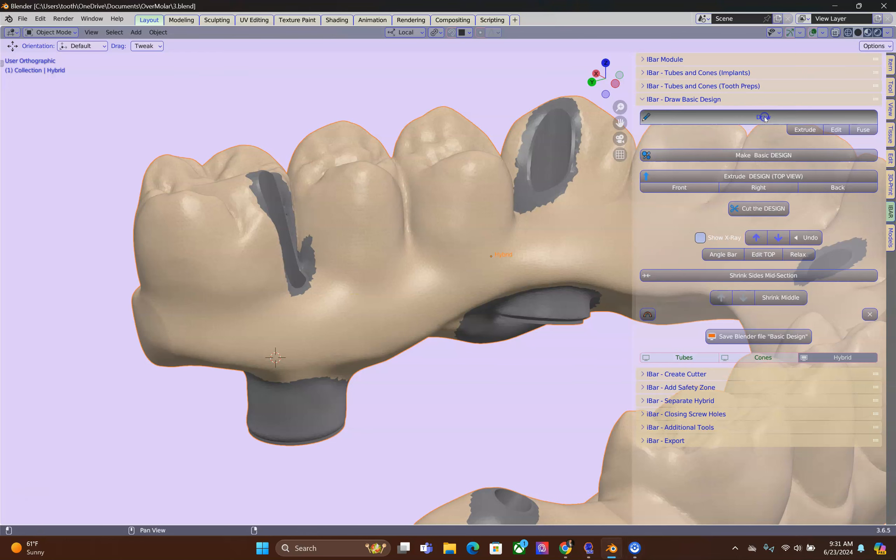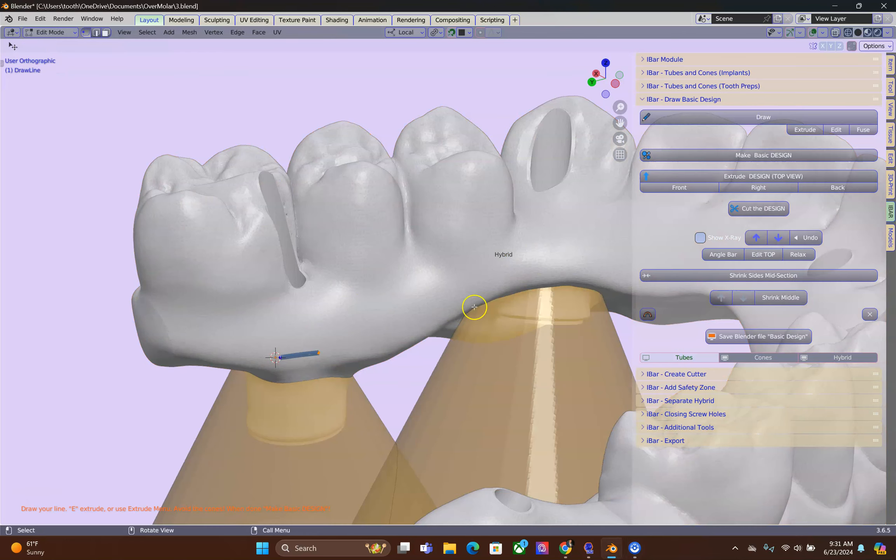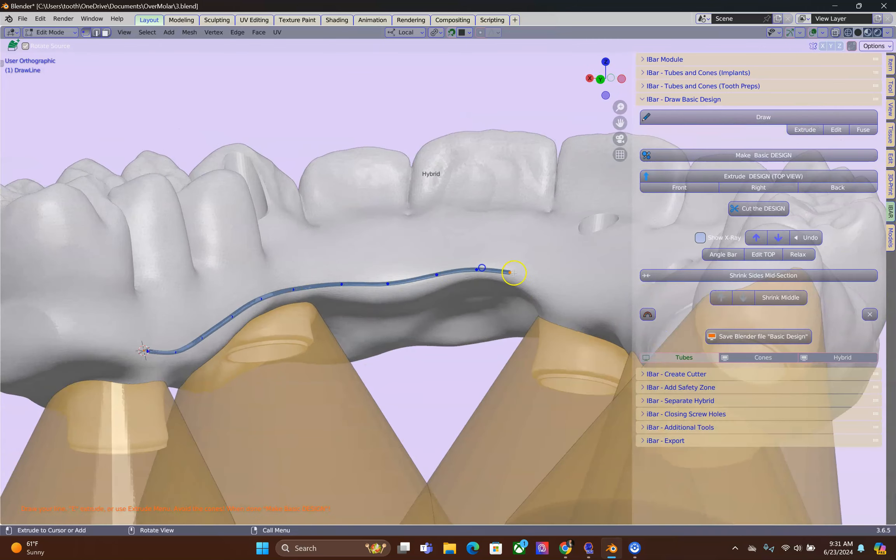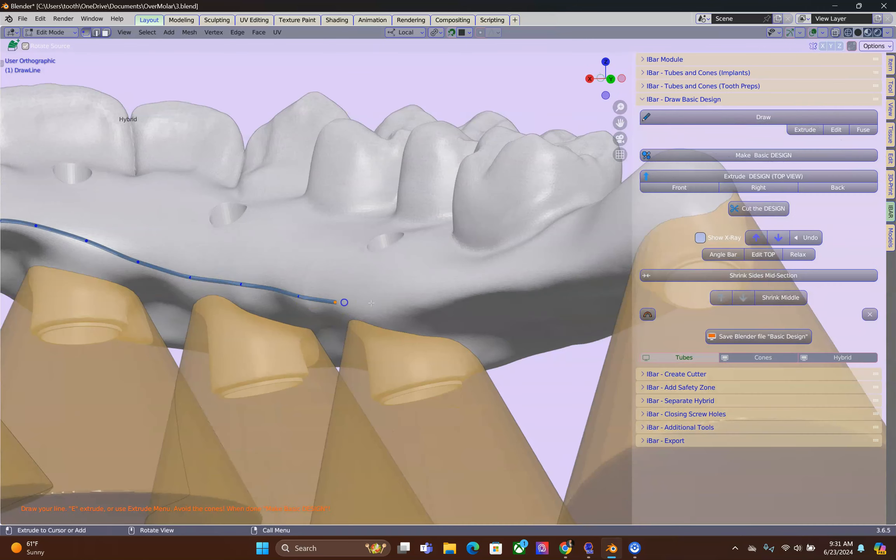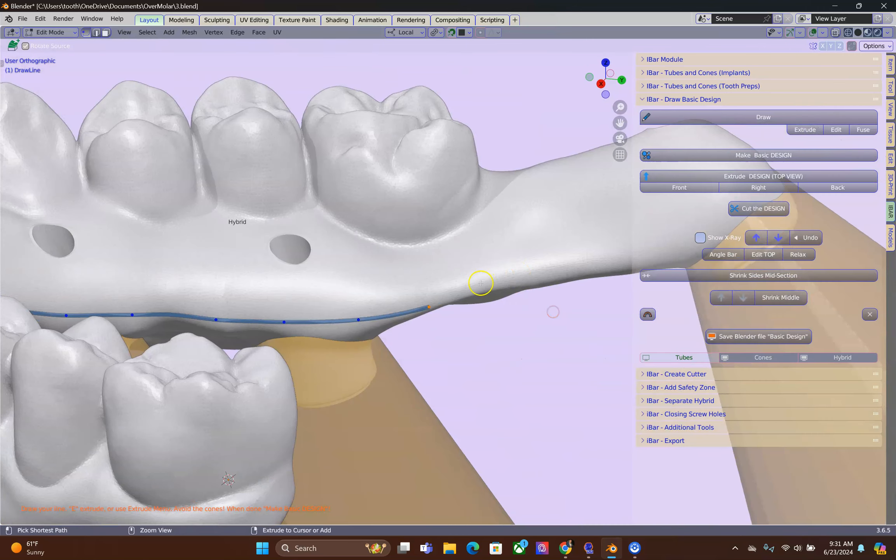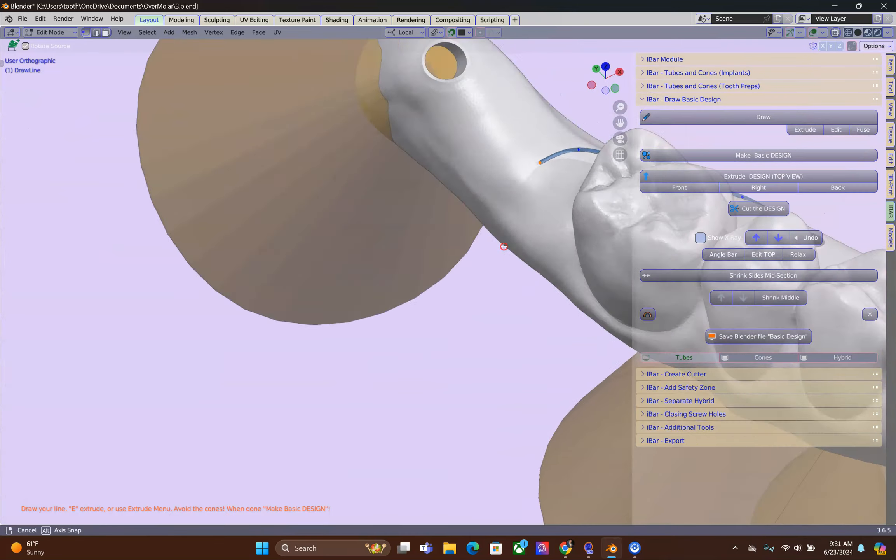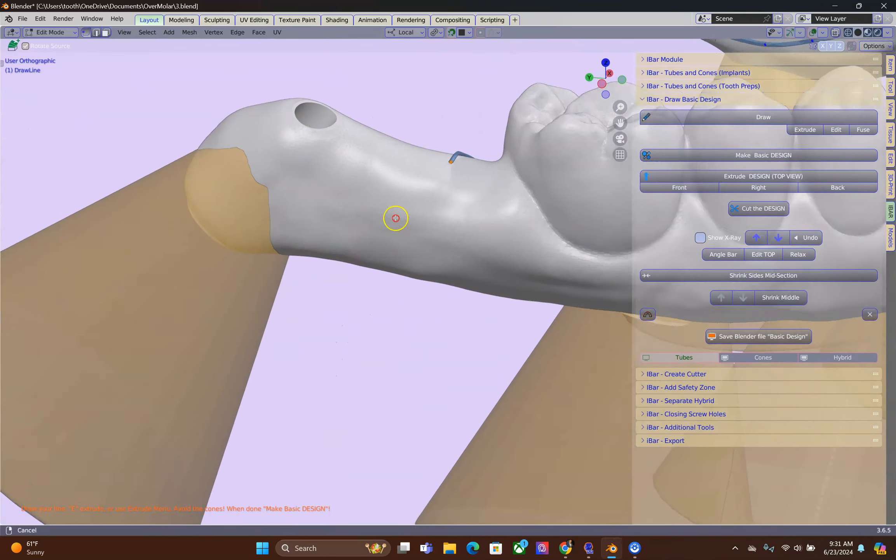Alright, we're going to click on Draw and then plot your vertices. Alright, when we get to the molar we need a very gentle incline. This is important.